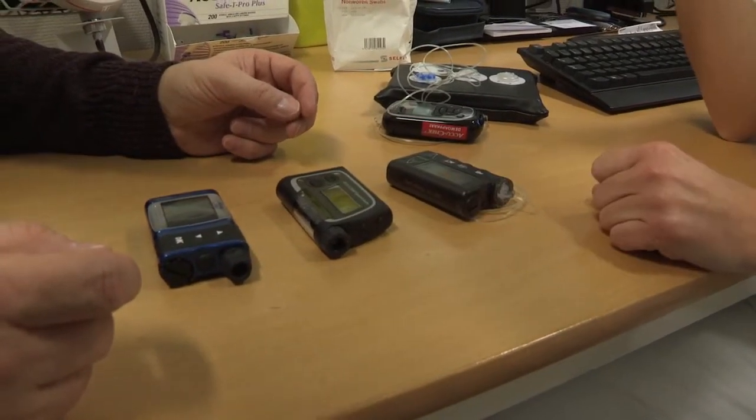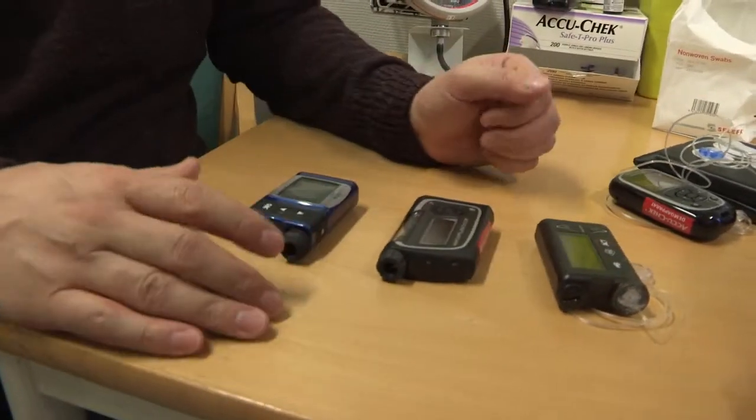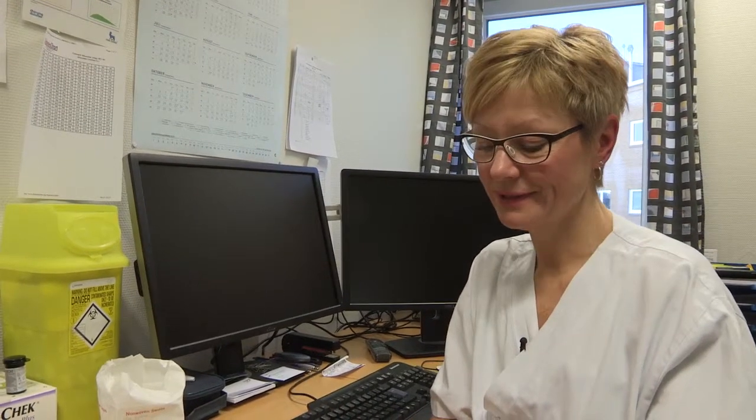You have to have a bit of knowledge and what to do in some alarms. So basically the patients, they come and you fit them with a pump. And are they taking the pump home with them? Yeah, often we do it like that: the first day they come, I show them the pump and they go back home. And if they are living a long distance from Tromsø, they have to stay at the patient hotel. And next day they come back and show me what they have tried and how it goes. And then we start the pump.